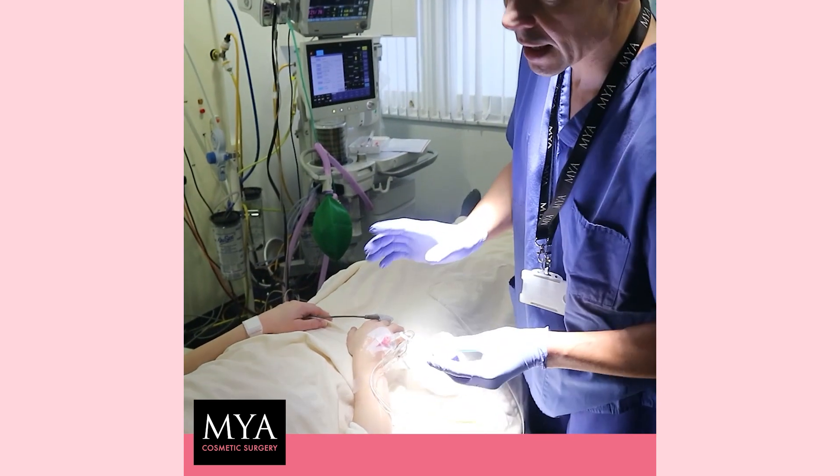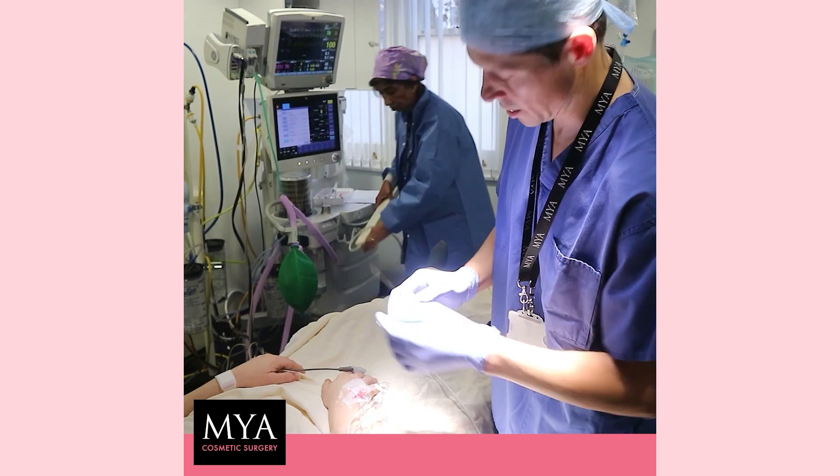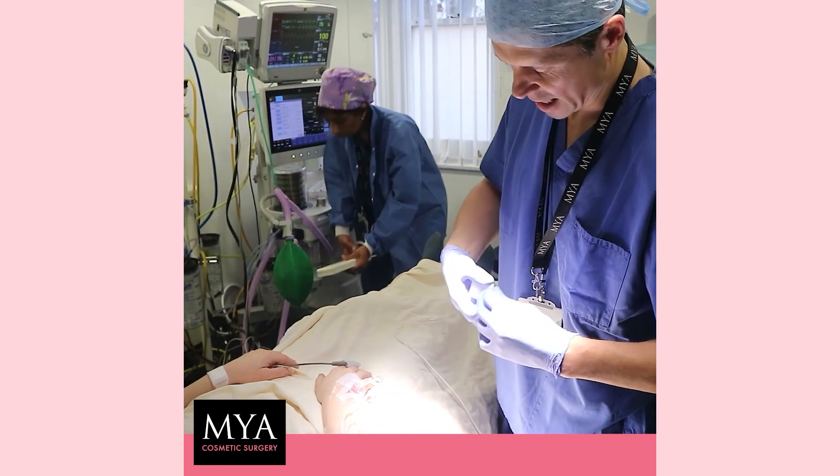So in a minute or so you'll start feeling a little bit drowsy. Just a bit of sedative going in. Let me know when you do.